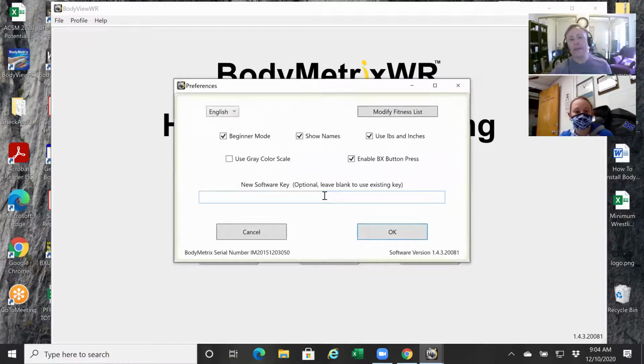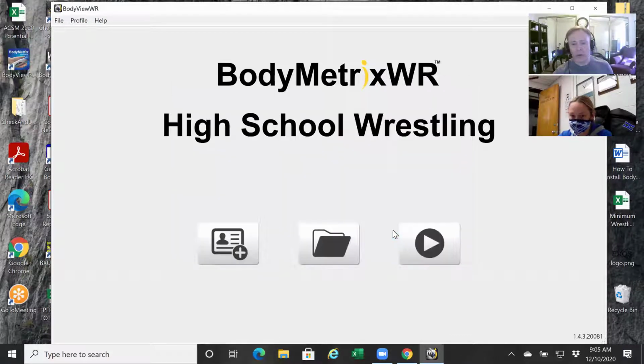I just need you to make sure that you have a check mark both in the Show Names box here. Probably looks like that. You just click inside that box. And also this Enable BX button press box. Okay. And once those are checked, we'll click OK and we're good to go.